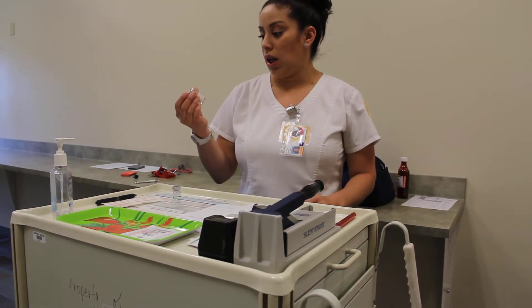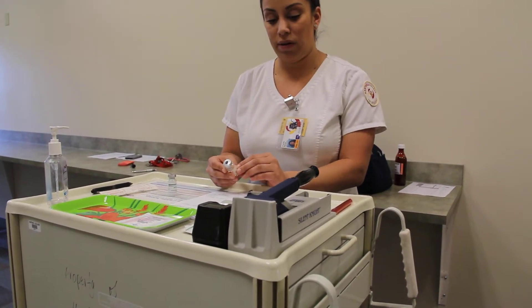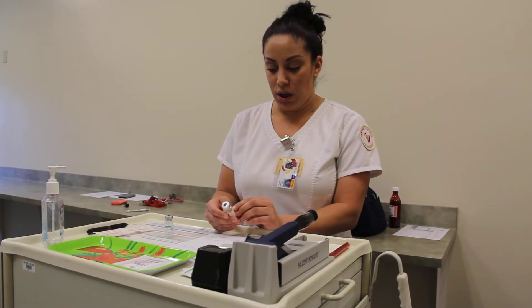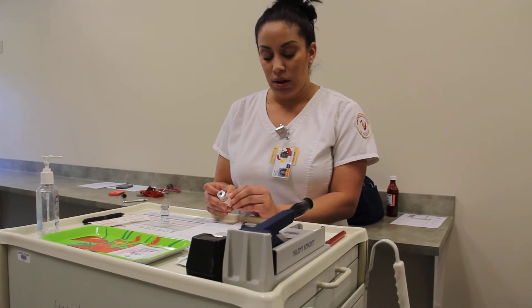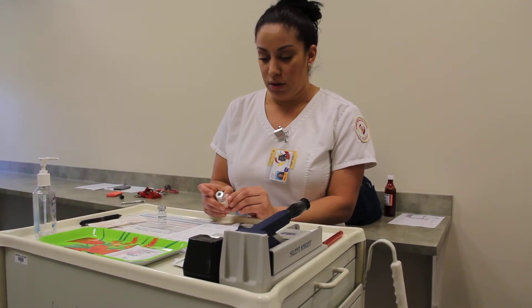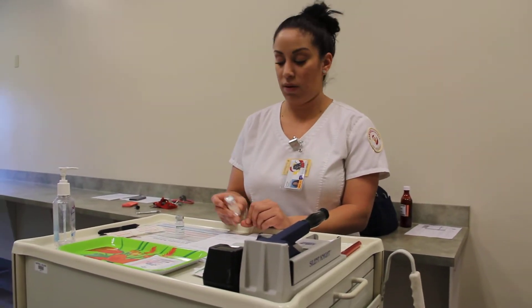I'm going to take my second medication, which is my regular insulin. Right patient is Mary Smith, right drug is regular insulin, right route is sub-Q at 900, and I'm going to be administering three units.